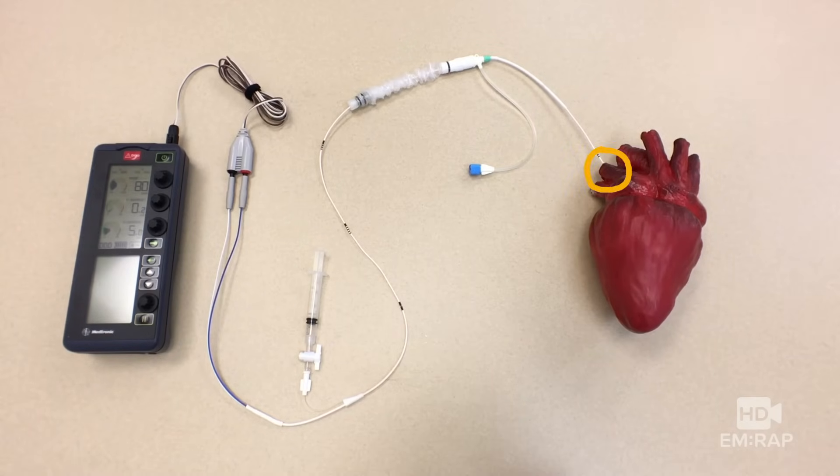From the right ventricle, the pacing wire comes out the SVC and through the right IJ where you placed it. You have a sterile sleeve over the top of the sterile pacing wire. This syringe inflates and deflates the balloon. And then through adapter pins, it plugs into the connecting cable, which goes into the pacing generator.